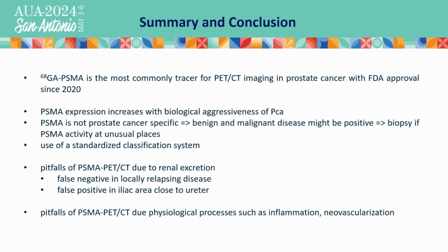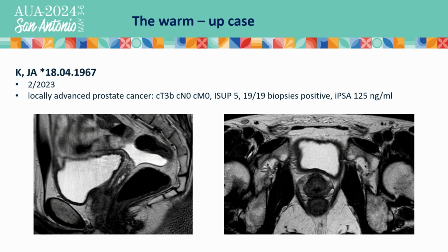As I said, there are some pitfalls of the PSMA PET CT scan due to renal excretion if you use the gallium PSMA tracer, resulting in false negative and maybe also in false positive results. I guess we can just discuss two cases before I transfer the presentation to Deborah Kay.